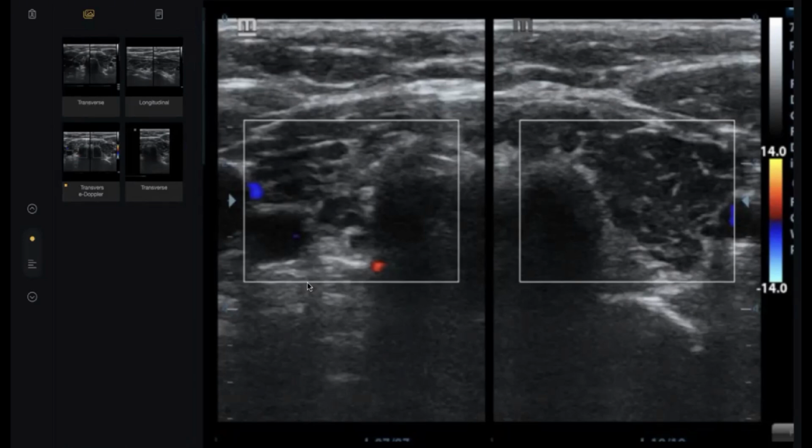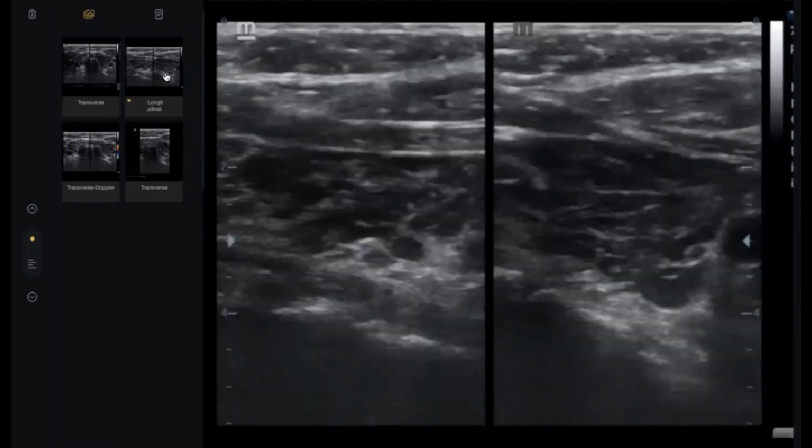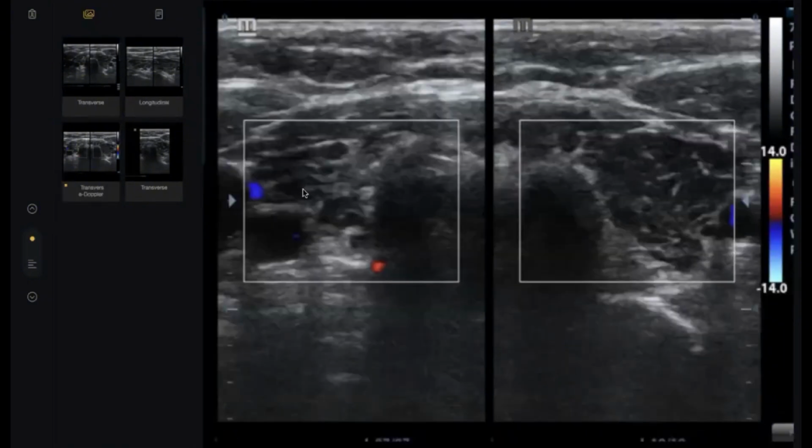Thank you, Dr. Umair, my colleague. My advice to all of you: the examiner wants two buzzwords from your side. Number one, after description and everything, this is thyroiditis. At the worst, at least we should tell the thyroiditis, or it is better to tell him this is Hashimoto.